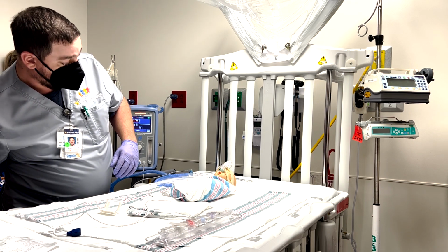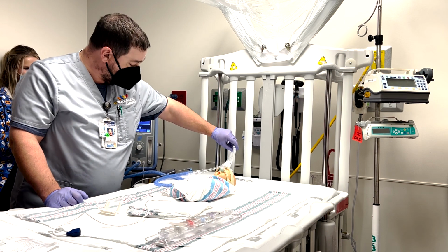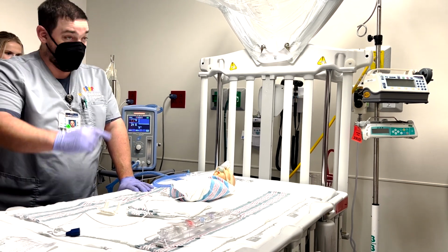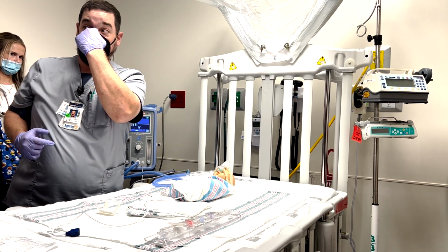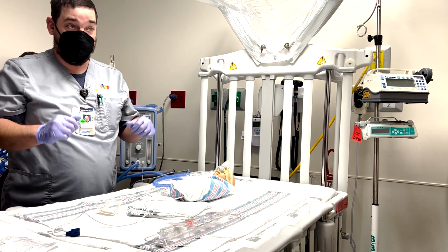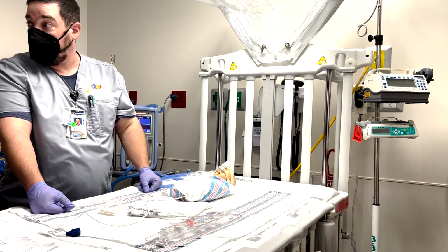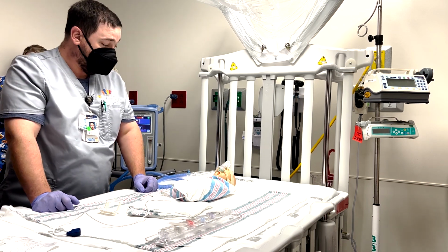So far, so good. Big thing that you'll run into with respiratory therapists, especially, baby skin is tender. You know this as much as I do. We like to do skin checks every 3 to 4 hours, and that includes the brow and the pressure points from where the mask holds, right here on these sides, usually on the septum. Same with the prongs. We want to make sure that we're not able to drive a truck when we pig nose the babies, as well as the pressure points, because skin can easily break down. Skin can easily be blistered, bruised, battered. We don't want that for any child.